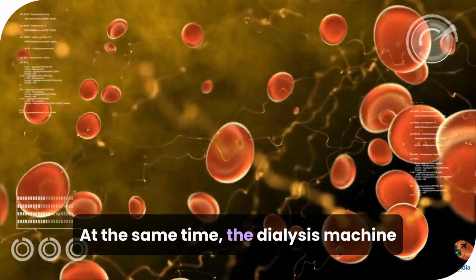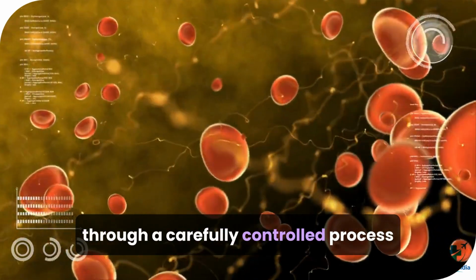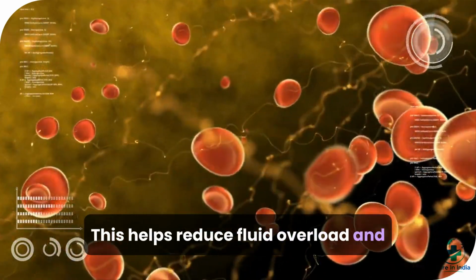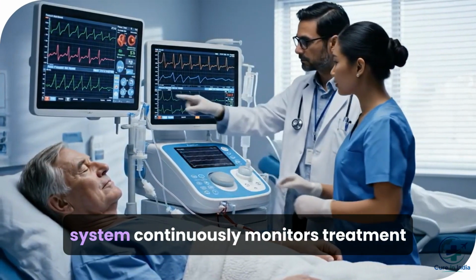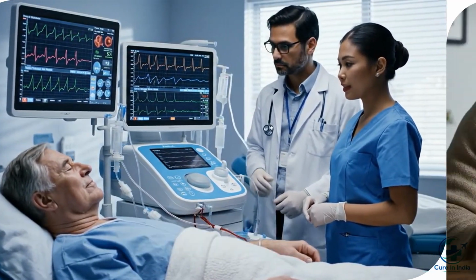At the same time, the dialysis machine can remove excess fluid from the body through a carefully controlled process known as ultrafiltration. This helps reduce fluid overload and supports healthy circulation. Throughout the session, the dialysis system continuously monitors treatment parameters to help maintain patient safety and comfort.